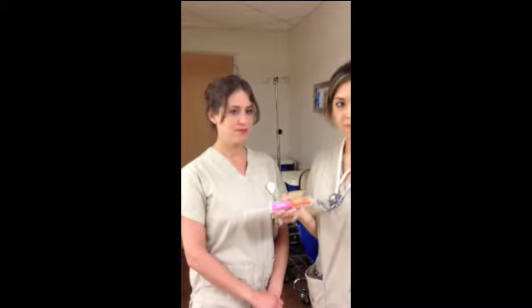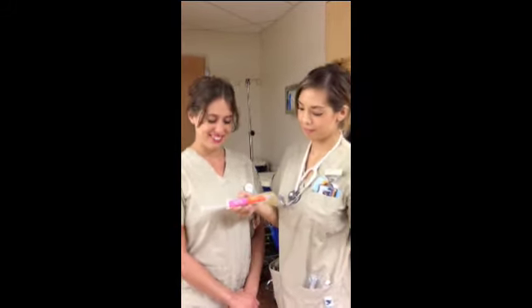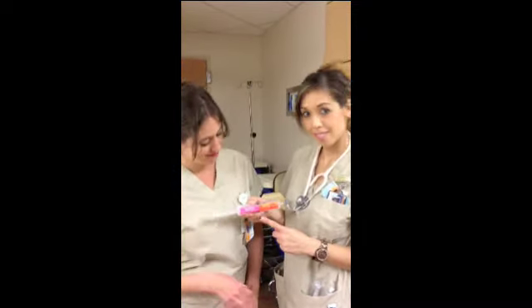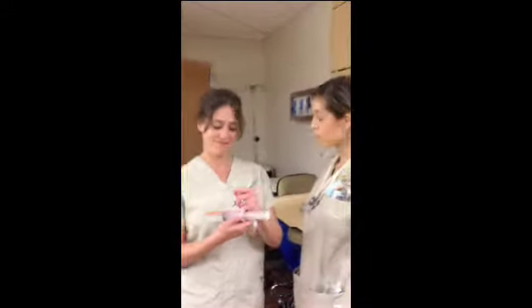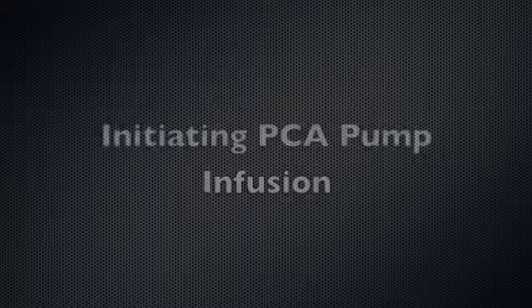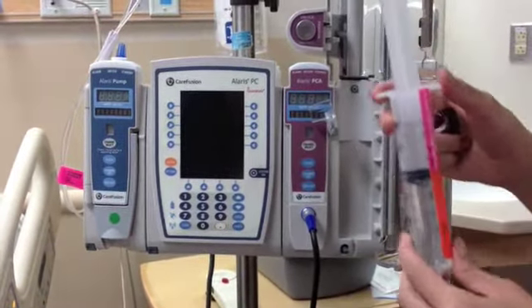Prepare the medication that you will be infusing into the PCA. Take note of a fluorescent non-standard concentration sticker located on the syringe. Make sure to have a secondary nurse co-sign to verify the dose of the drug and the concentration. Turn on the infusion pump.